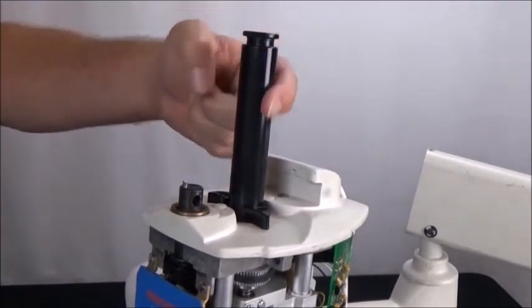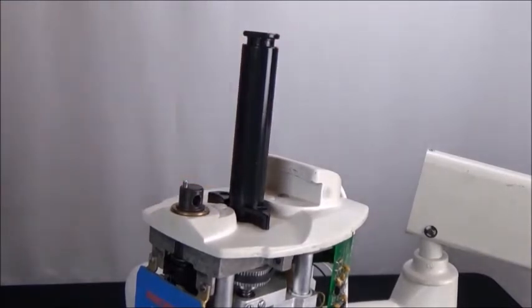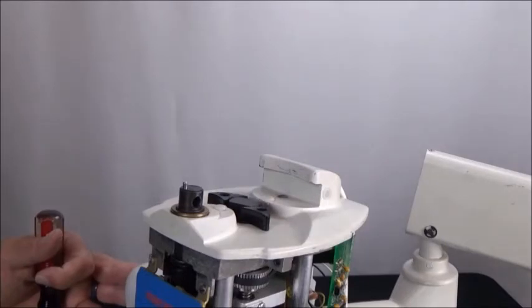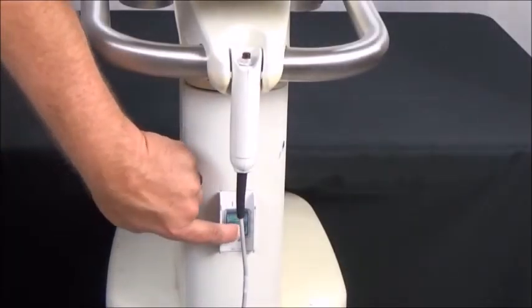Apply another coat of dielectric grease to the piston, then fully retract the piston again. When finished, turn the injector off and unplug it.